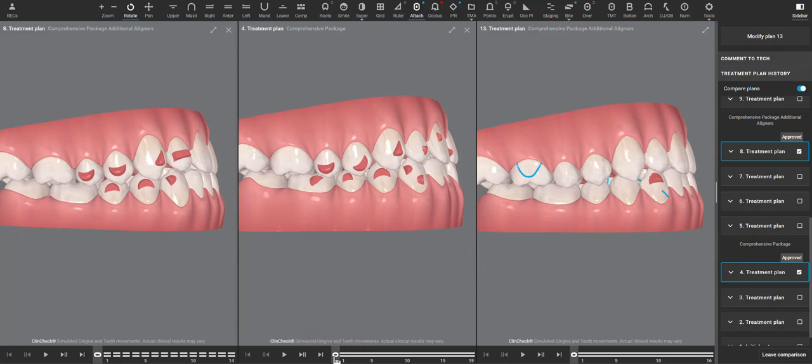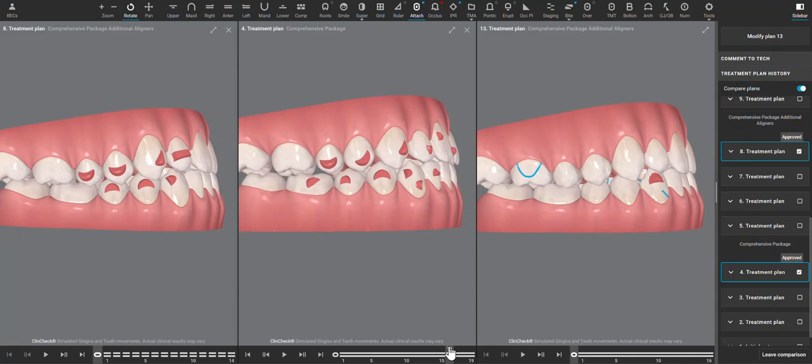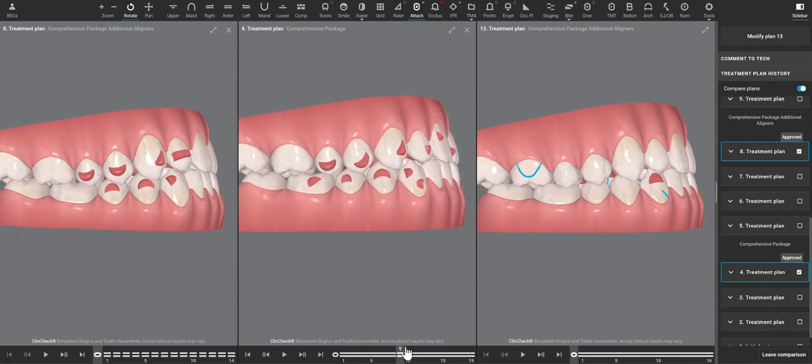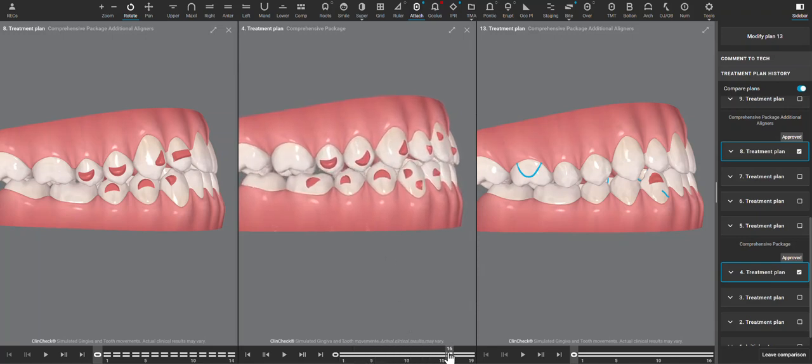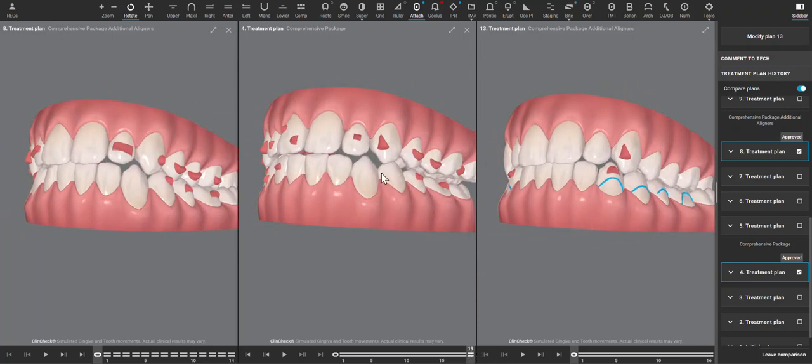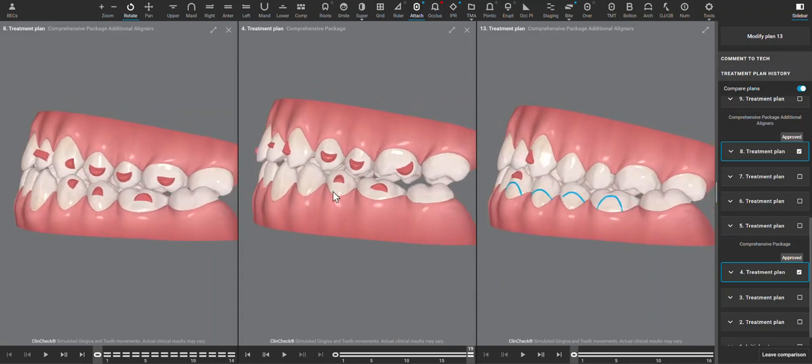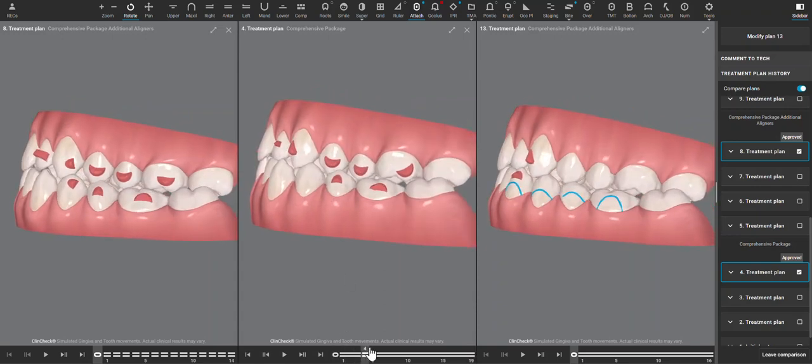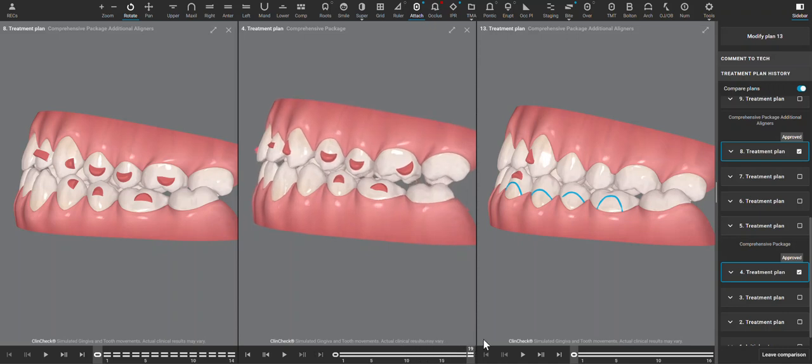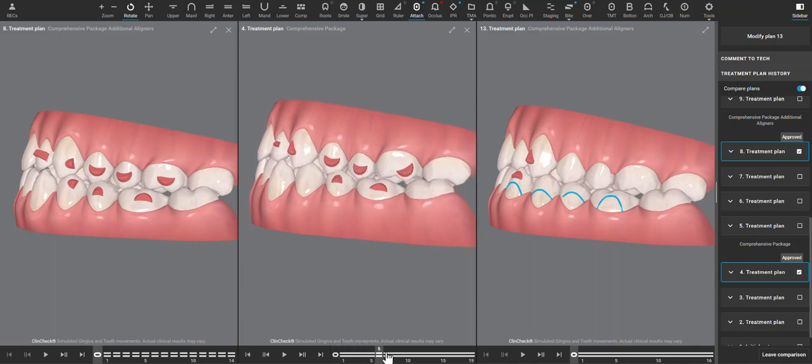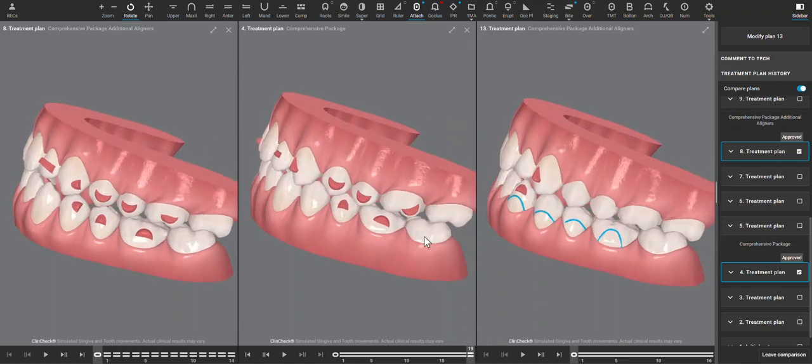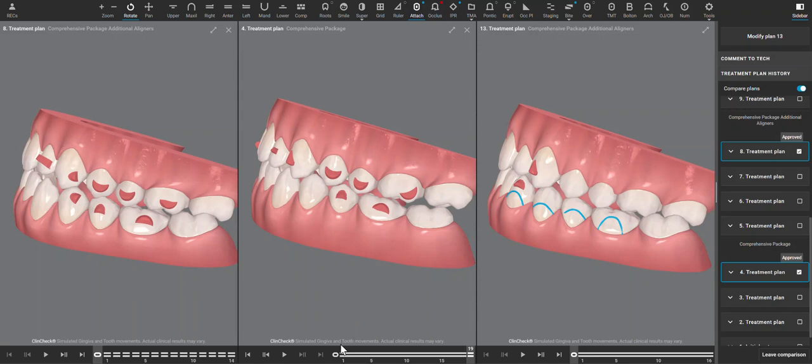Let's go ahead and look at this ClinCheck and see what movements were intended, in which there was a lot of lower anterior intrusion, some intrusion of the posterior teeth, and then what looks like a virtual jump where the software is going to assume that the jaw comes together better. A warning sign is a lot of the second molar movements, as these teeth are not going to move very predictably if they move at all, especially a big intrusion of a lower molar and a crossbite correction.